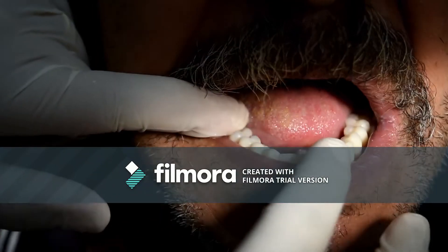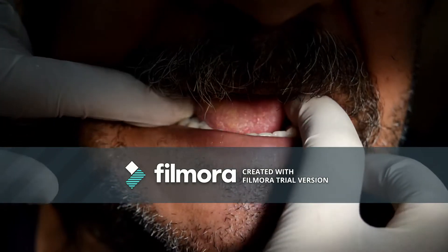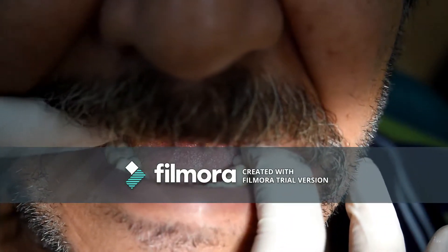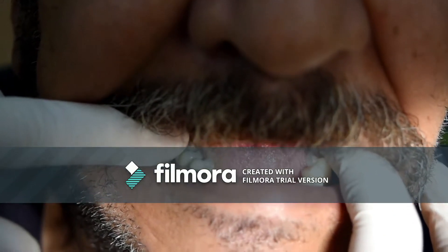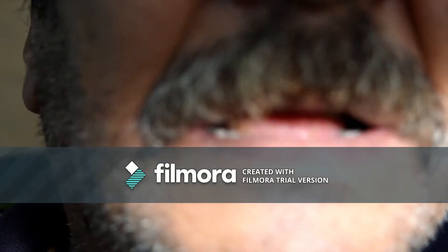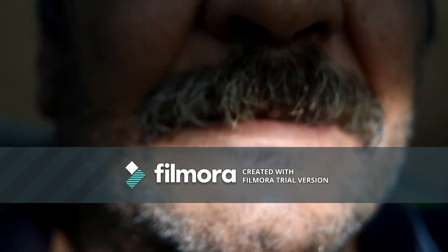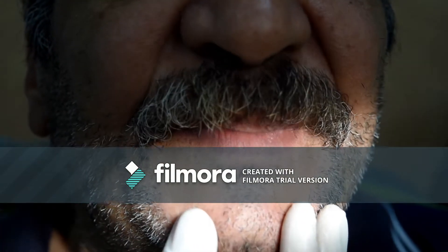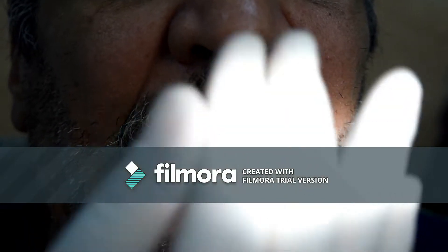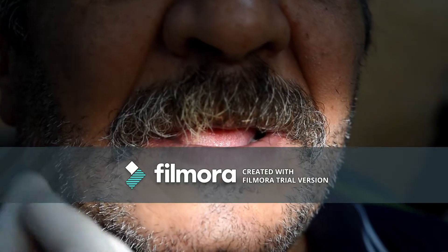To check this, ask your patient to relax his tongue behind the lingual surface of the lower anterior teeth. The lower occlusal plane should not encroach on the tongue space. To test this, ask your patient to raise his tongue slowly. If the posterior teeth are encroaching on the tongue space, this will cause your denture to rise from its place.